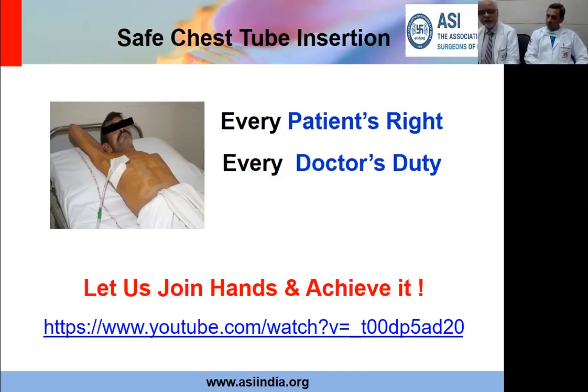One related point on the technique of insertion: some people have mentioned that after you have entered the pleura, you put in a finger, making sure you have reached the pleural space and also taking down some of the adhesions that may be present between the lung and the chest wall. Do you think this is a good maneuver, or should it not be done, or will it make your incision larger and be counterproductive?